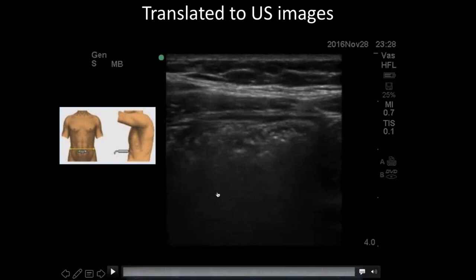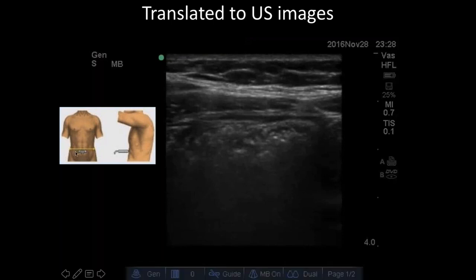We're going to take a look now at the area that I was talking about, the right lower quadrant. So you're going to use the linear transducer and move from right lateral all the way to medial. So this clip is going to show what that looks like as you transition from right lateral towards the medial area, where you're going to go through a lot of relevant anatomy. So skin, subcutaneous tissue, and muscle, and then intraperitoneal lining right here. You're going to see large bowel here, most likely cecum, and then the psoas muscle right here is going to come into view, and as we move further and further medial, the iliac vessels are going to turn up on this side. I'm going to play this clip right now.